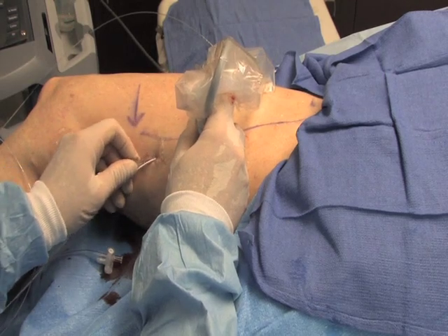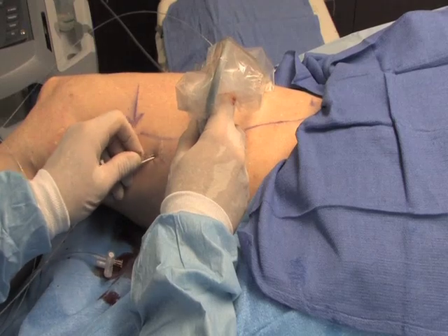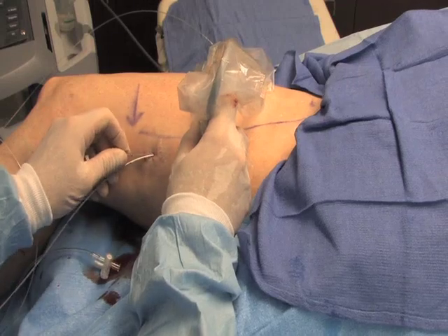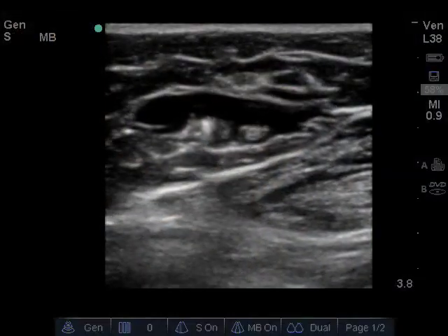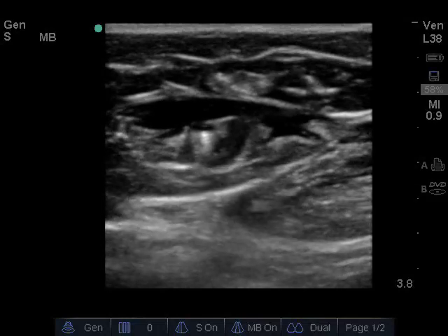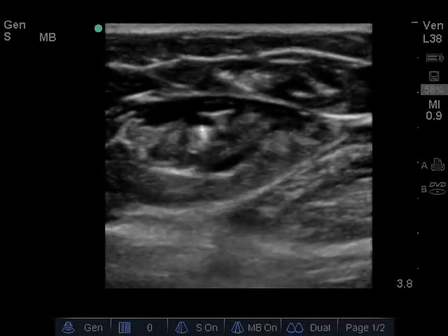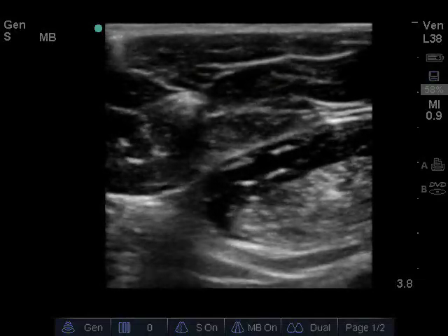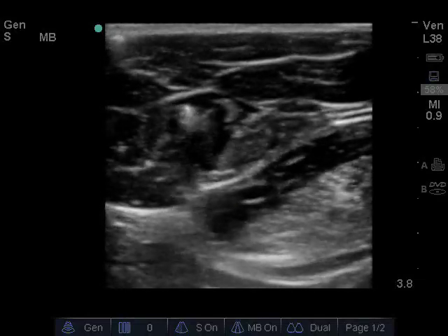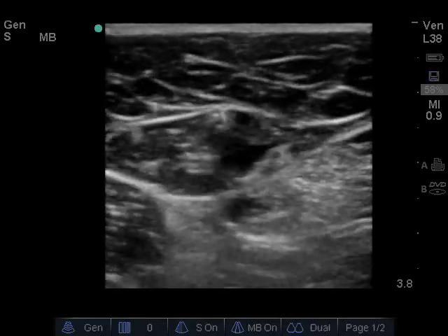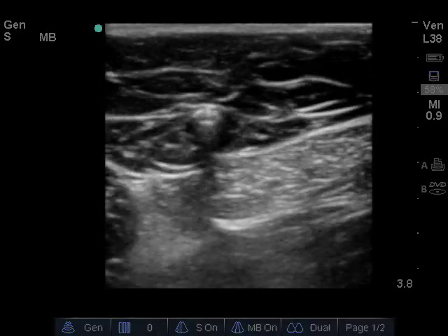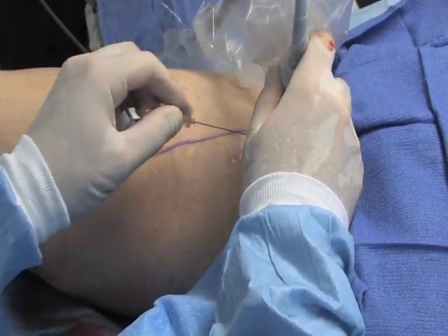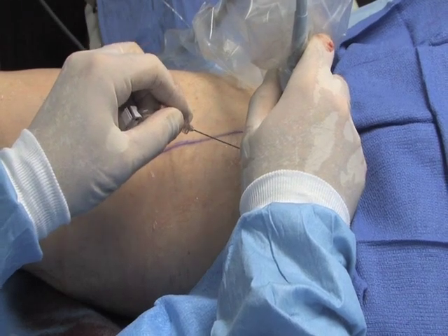Under ultrasound guidance, insert a 3-inch 23-gauge spinal needle adjacent to the insertion site of the introducer sheath. Use a Klein pump to infiltrate the entire tumescent solution perivenously. The hypoechoic tumescent solution will separate the anterior and posterior fascia that surround the vein and create a perivenous halo that is 1.5 to 2 cm in diameter. Use a liberal amount of solution to ensure that the tumescent extends all the way to the sapheno-femoral junction.